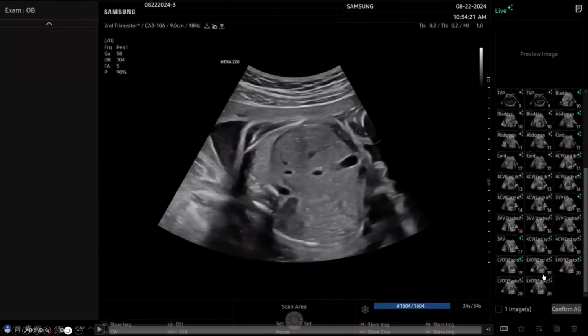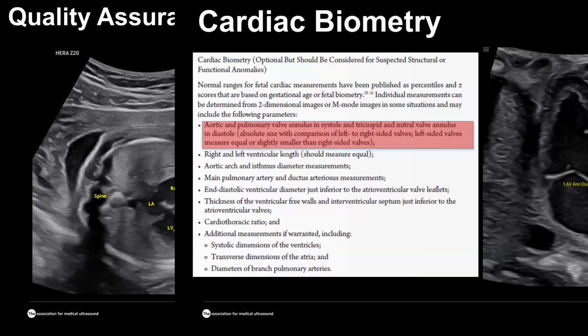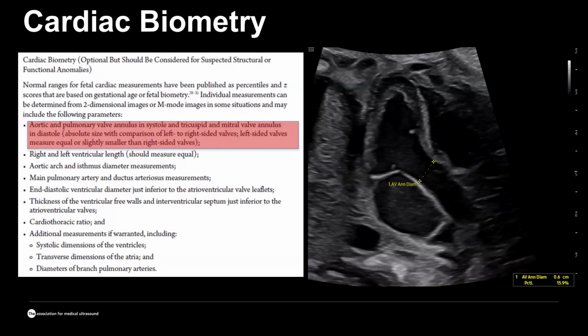And if you look into them, here is an example of the images which are automatically recognized, captured, labeled, and saved by the system. You can see that for the cardiac screening, for example, it's pretty amazing, in particular when we are dealing with a very novice operator. So this is a really interesting technology that, from my perspective, cannot be just a tool for quality assurance of your scans, but also could have a lot of potential for education in the field of cardiac imaging. So what are the other tasks that we have using the imaging in 2D?